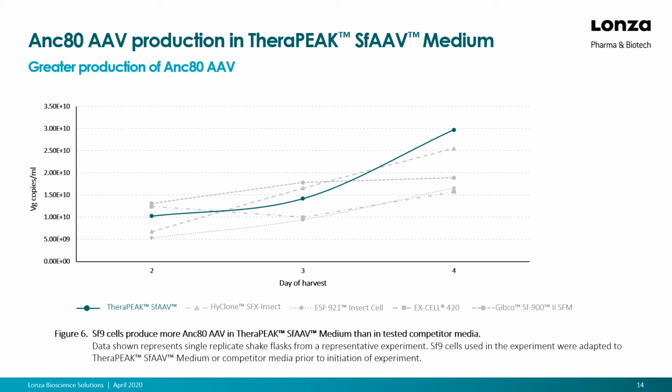This means that no patient has ever seen this viral vector, and thus no one has antibodies to it. This allows you to treat all patients instead of just 50% of the population that haven't already developed antibodies against serotype 2, 8, or 9 and other common AAV viruses.